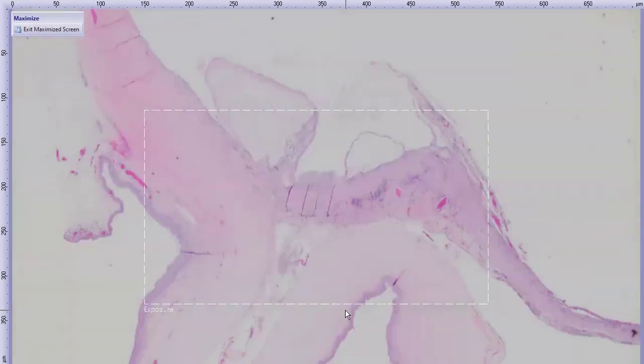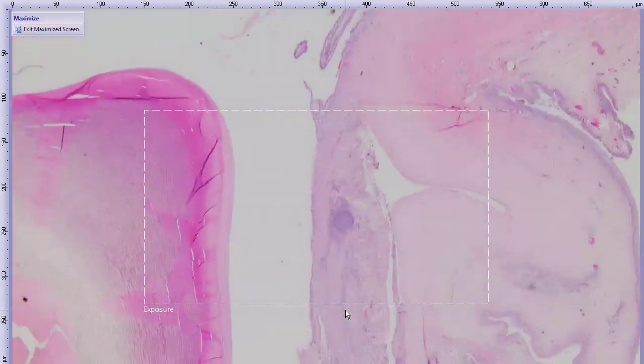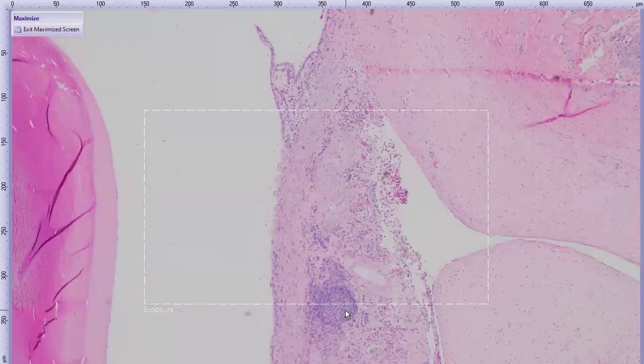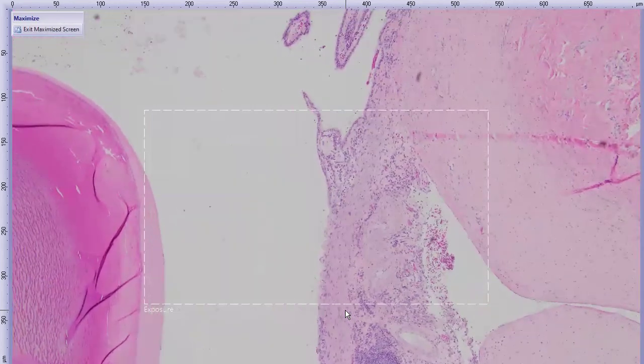And in fact, I've pulled this 6-year-old spayed female Siberian husky eye to show that off. So ignore the fact that there's a giant corneal perforation. We're just going to skate right over that. This patient had documented uveodermatologic syndrome. There was also depigmentation of the nasal planum. So we know that this patient had uveodermatologic syndrome. We have some history to back us up again.